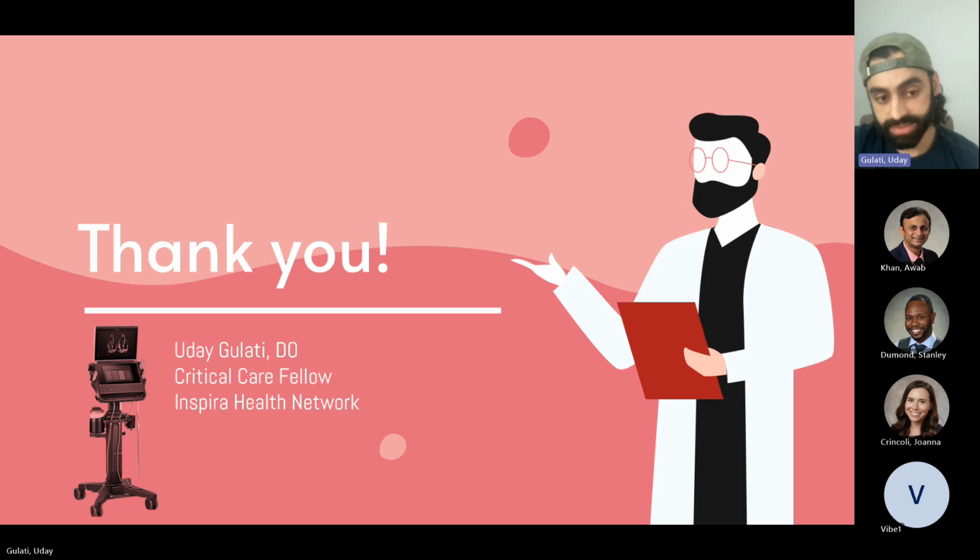So once again, we'll practice actually doing VEXUS scans either in person or at a separate POCUS hands-on session in the coming weeks. But that should cover the majority of the didactics portion of this. With that, I'm sure you guys have a lot of questions. What can I answer?